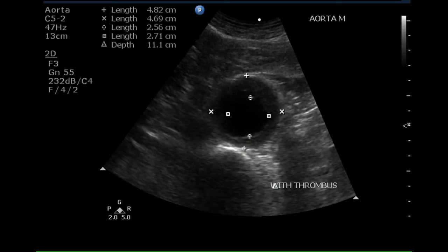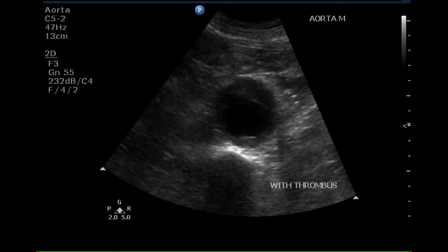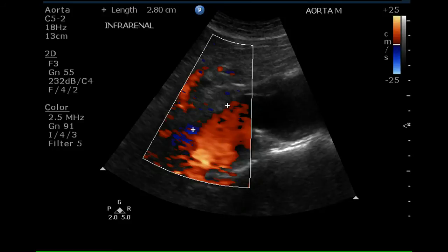The maximum diameter of the flow lumen is 2.7 centimeters. This is an area of color Doppler at the superior portion of the aneurysm. The origin of the renal arteries cannot be determined.